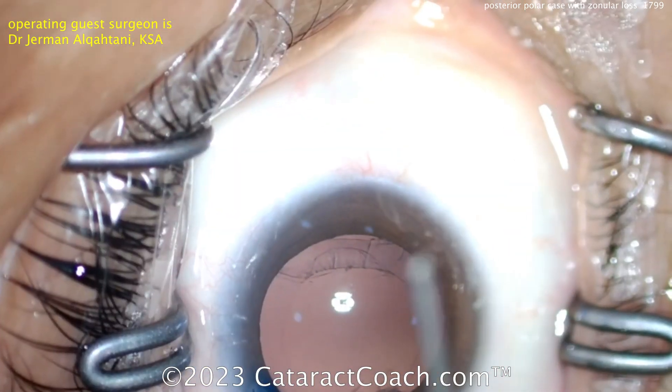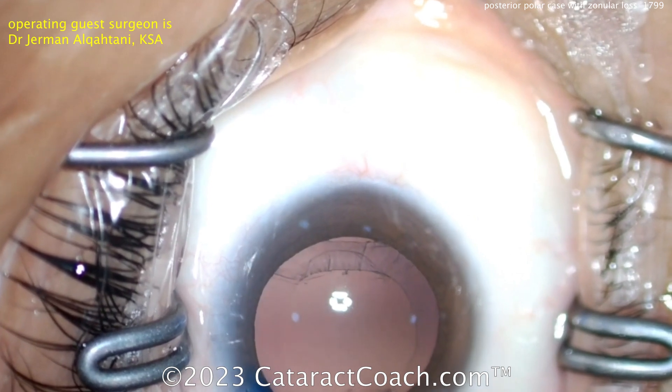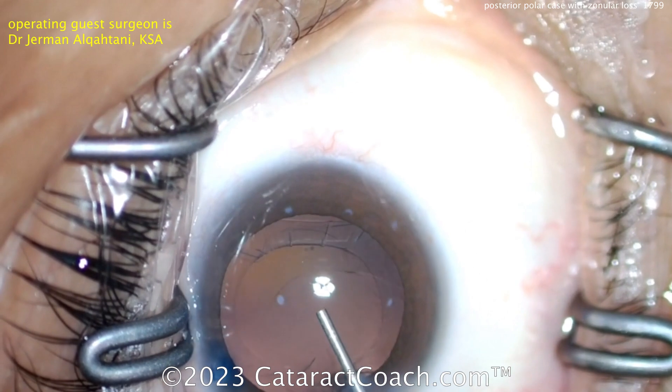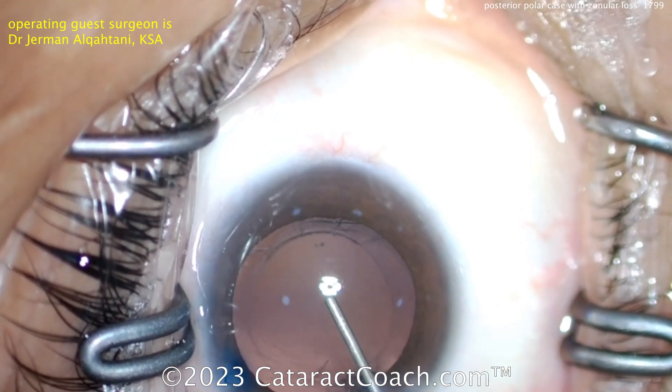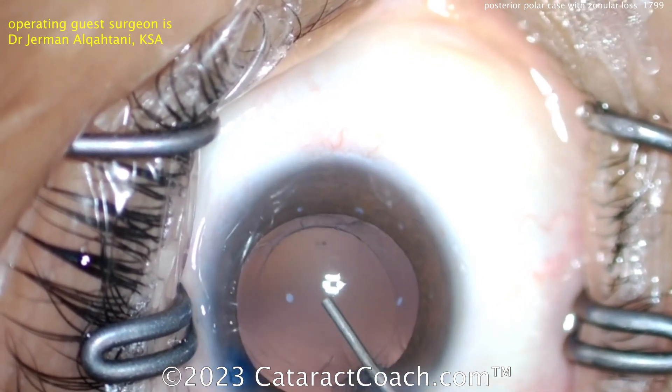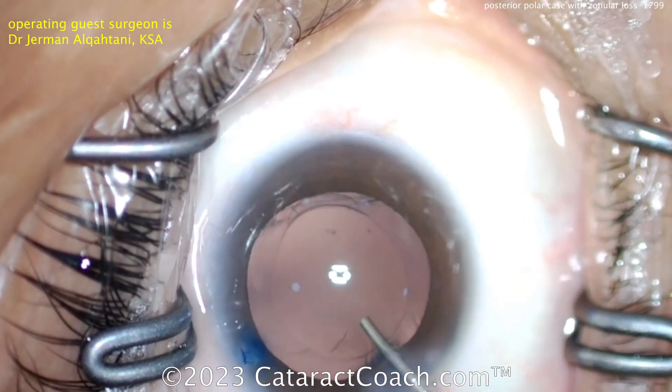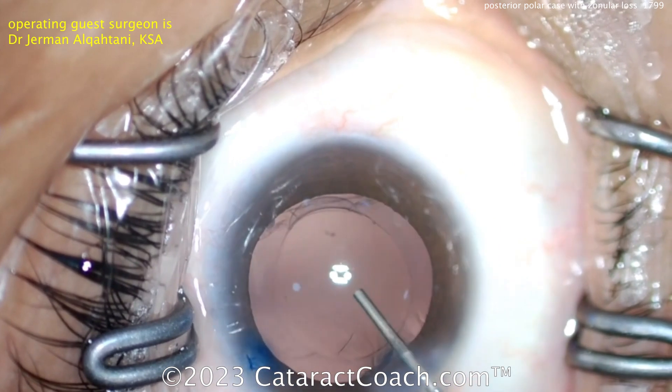Now you can see there's the capsular zonular loss — the capsule has collapsed, and now there's a big area of zonular loss. Viscoelastic is a good move — get that back in there. Hopefully the anterior hyaloid face is intact and you won't have any issues with vitreous prolapse. But now — what are you going to do?